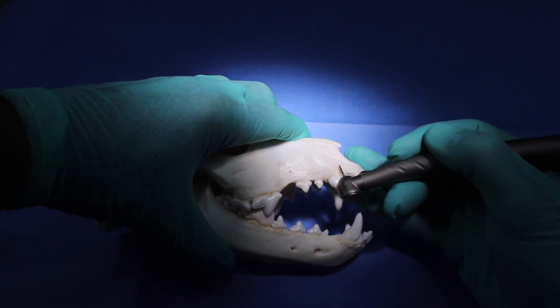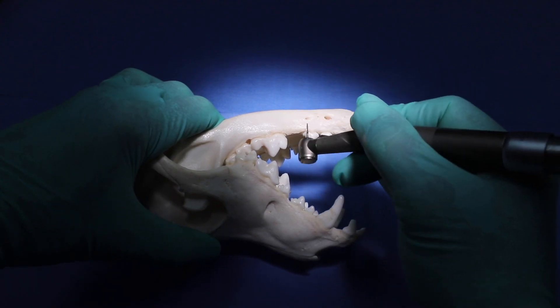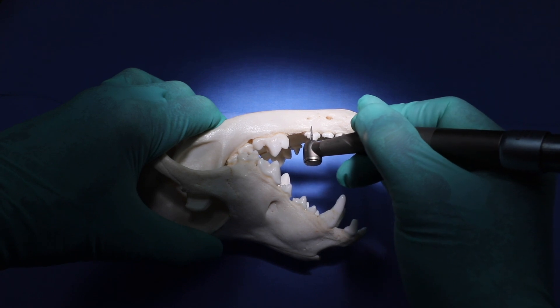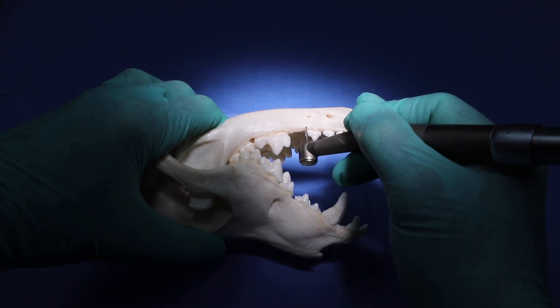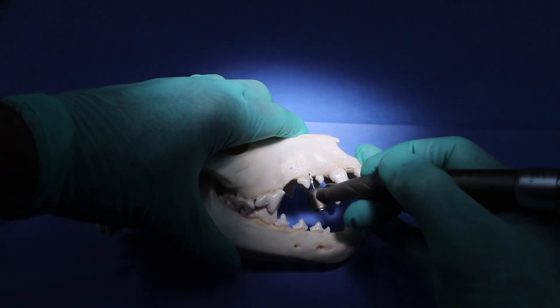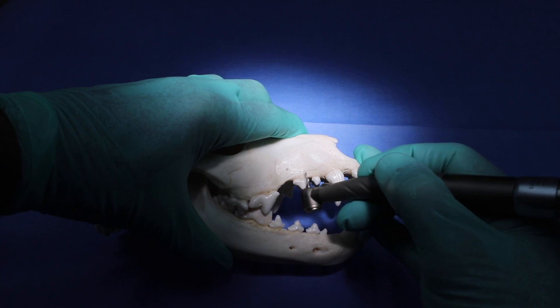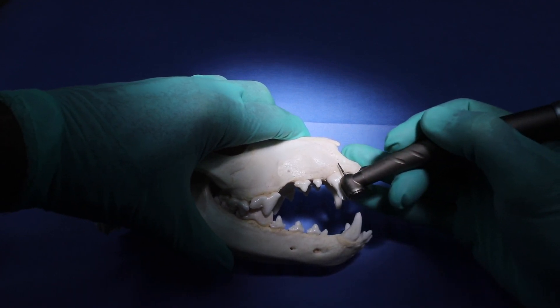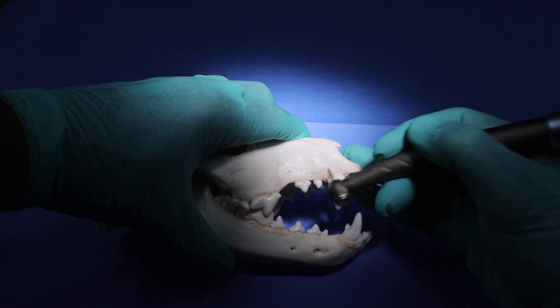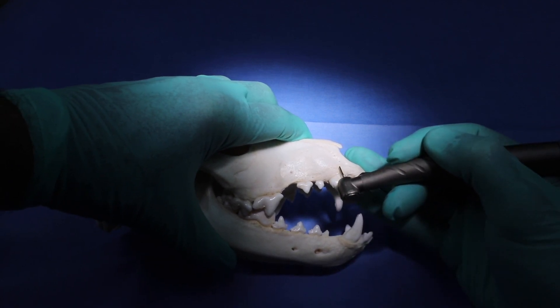Please notice that as I'm working on the mandible, the teeth are facing me. Then when I turn that patient over to work on the maxilla, the teeth are also facing me. That's the orientation you need to keep in mind when doing your oral surgery procedures, especially the surgical extractions that as general practitioners we do every day. Your extractions will be so much more efficient.